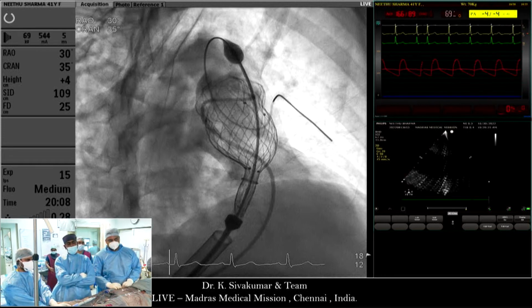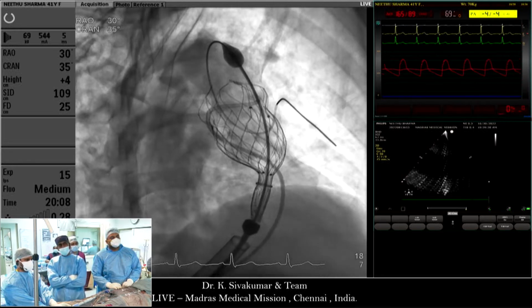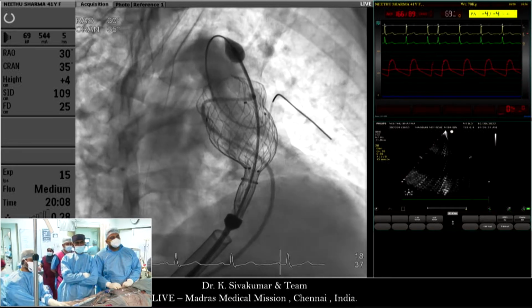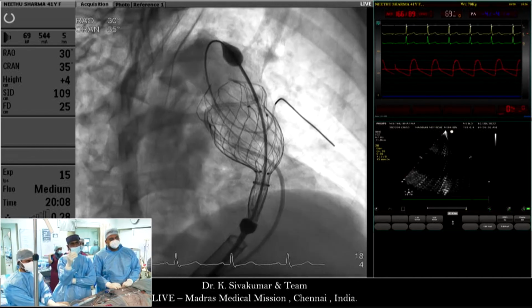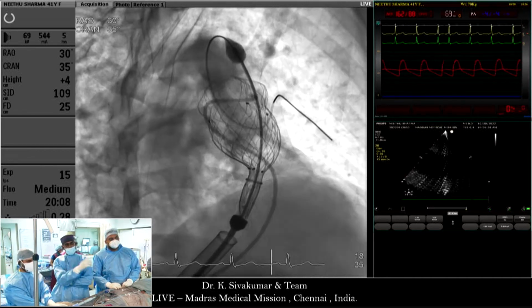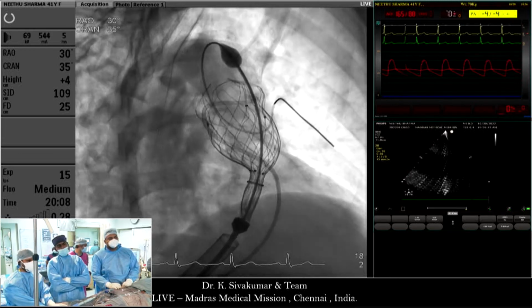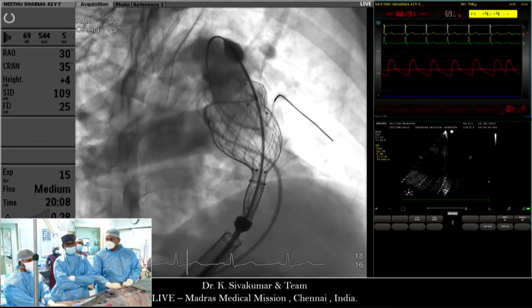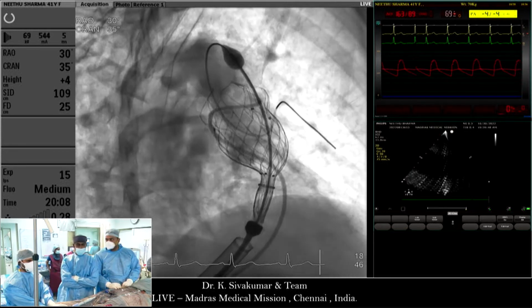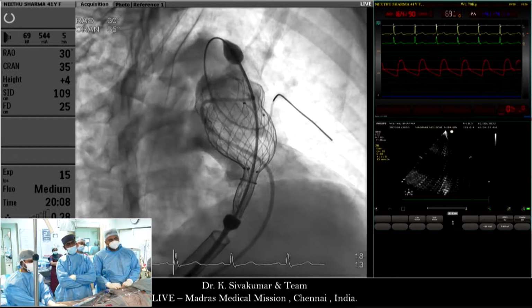You now see that the proximal flare, I am 1/3 released. 2/3 is still constrained. In one of the patients, we had 50% of the distal flare at the golden ring, and the whole valve dropped into the right ventricle. And I was able to recapture it completely with a 24 French long Cook flexor sheath, not this venous sheath, but the Cook flexor sheath.